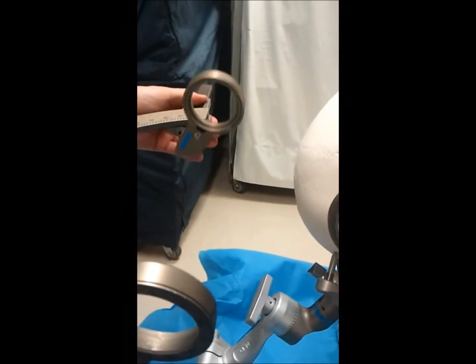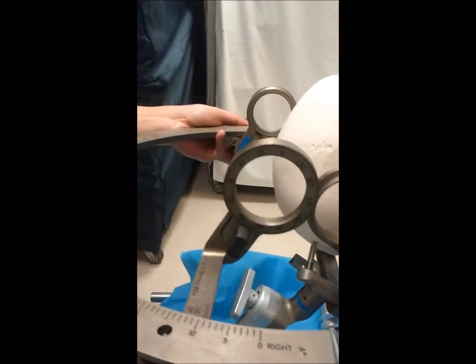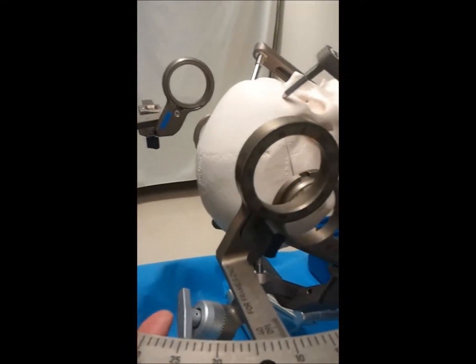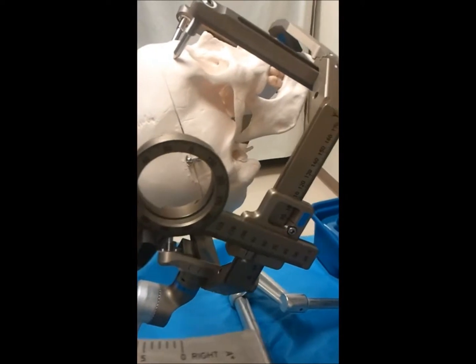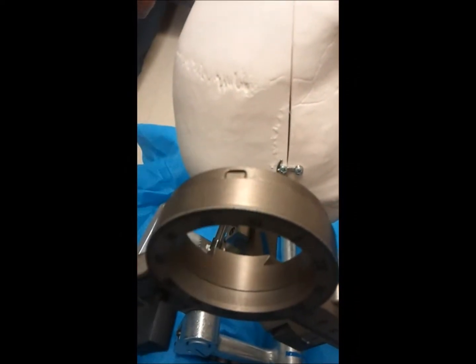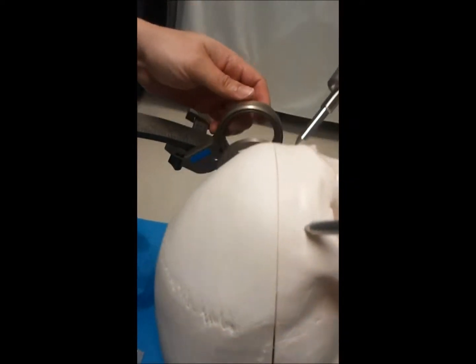So this left side again needs to be away because we would be bumping it if we didn't have that option. So we want to swing that all the way out on the left. And then we want to line up the right side first, lining up this ring into that notch. Okay? If you have an assistant, they can hold that. The next thing you need to do is adjust the ring on the left side.